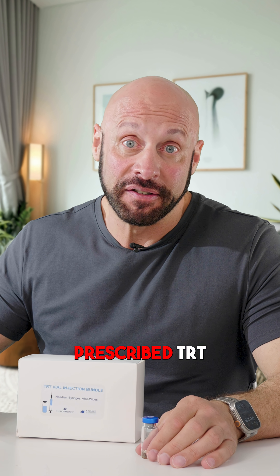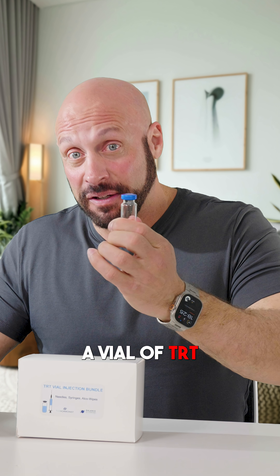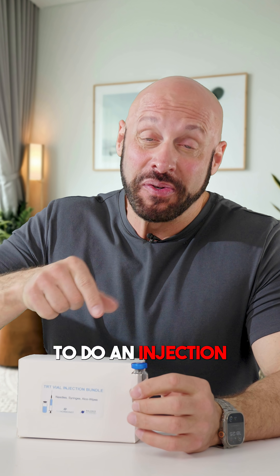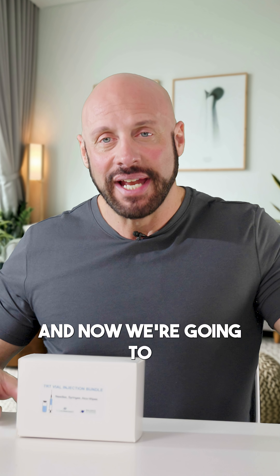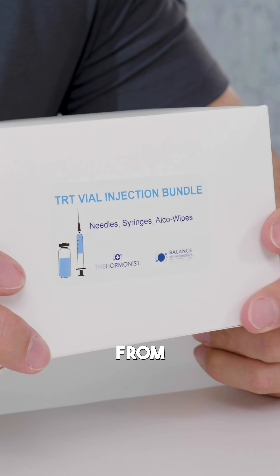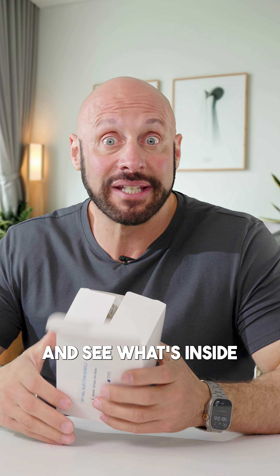So you've been prescribed TRT and you've been prescribed a vial of TRT. This is a vial, and you might want to know what you need to be able to do an injection if you've been prescribed a vial of testosterone. Now we're going to look at the pre-injection bundle or the injection bundle that you get from Balance My Hormones. So let's open up and see what's inside.